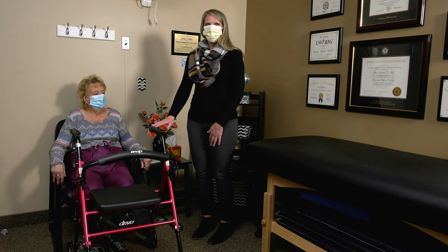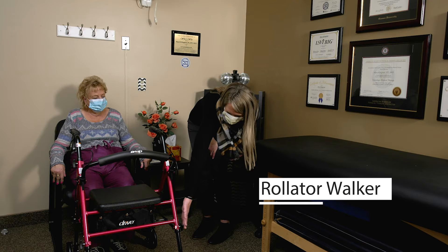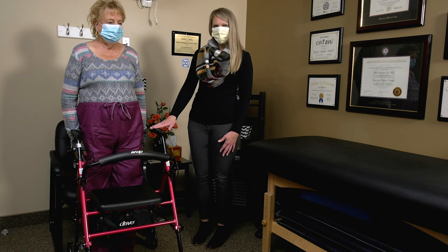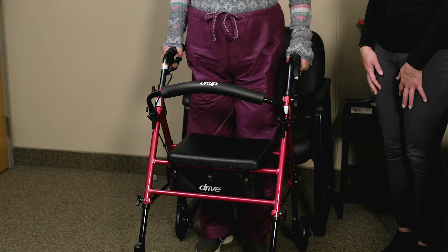This is a rollator walker, and we're going to talk about how to use it properly. The first thing you always want to do is make sure it is the appropriate size. These walkers are adjustable both at the top and at the bottom — you unscrew the pin, take it out, slide the pipe up or down, put the pin back in where you want it, and tighten it back up. Stand up and we'll check the height — relax your arms down by your side, and the top of the handle should meet right at the base of your hand when your arms are straight.